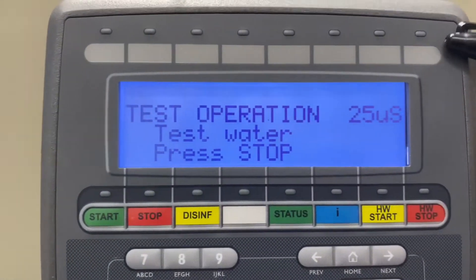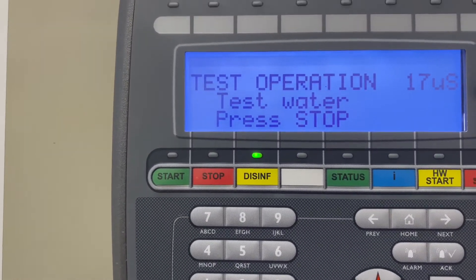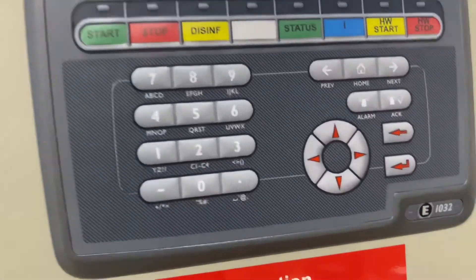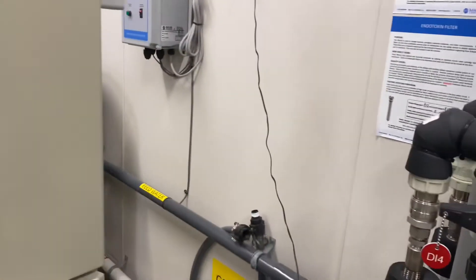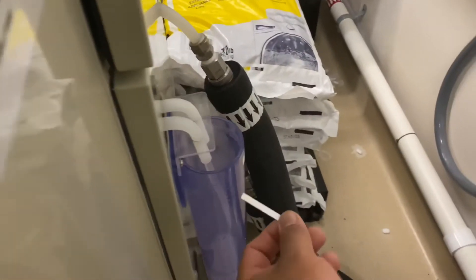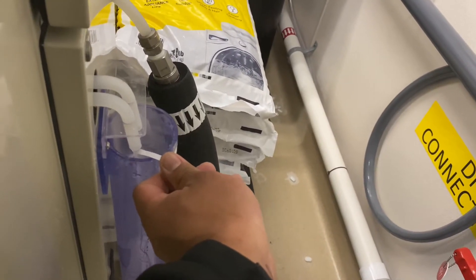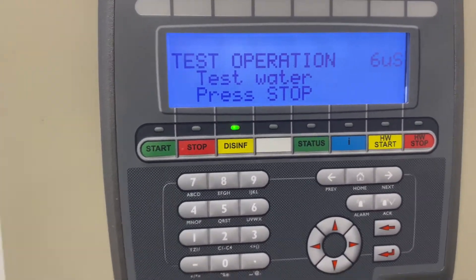When this number goes below 20 — it's 17 right now, then 13 — I can start checking. You guys see where the water is? And it's negative. We are negative.